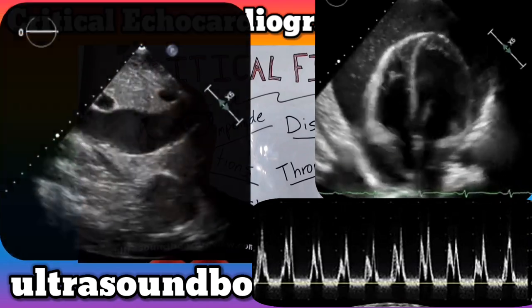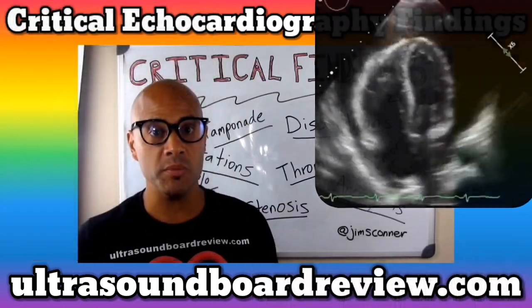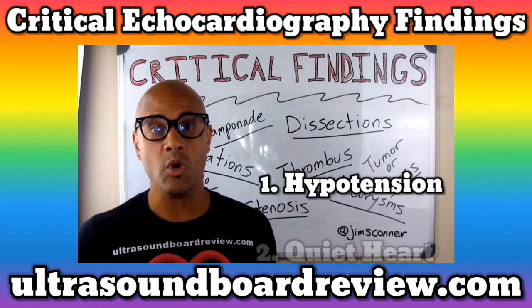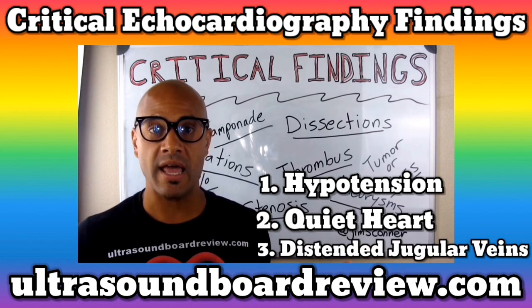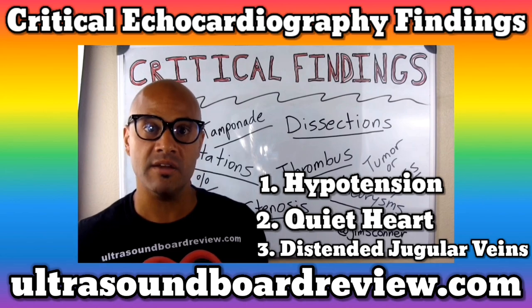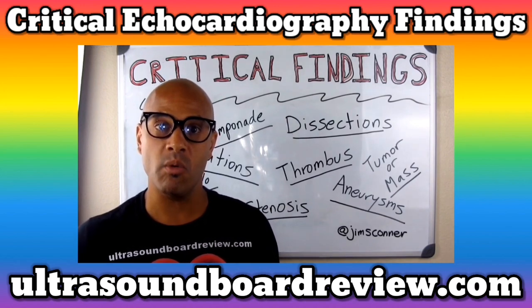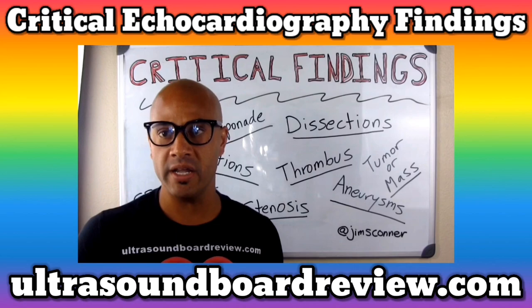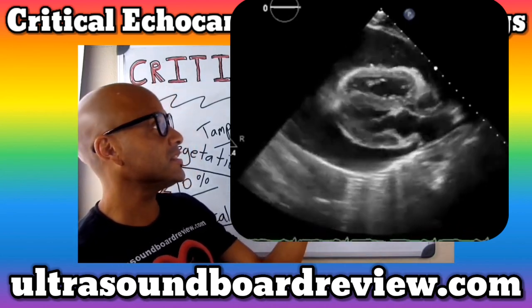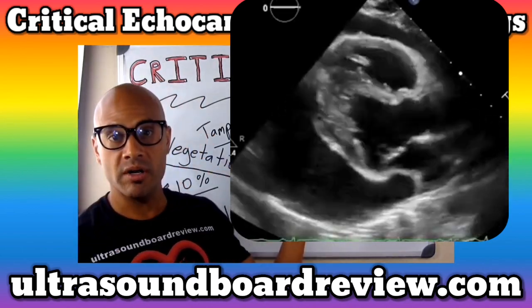Go to the subcostal view and check the inferior vena cava. The IVC will usually be dilated and non-compressible during tamponade. Remember, tamponade can only be diagnosed clinically using Beck's triad, which includes hypotension, quiet heart, and distended jugular veins. We use echocardiography to back up the clinical signs of tamponade. Quiet heart means that when you're auscultating with a stethoscope, you hear muffled sounds — because the heart is completely surrounded by fluid, trying to listen for heart sounds is nearly impossible.